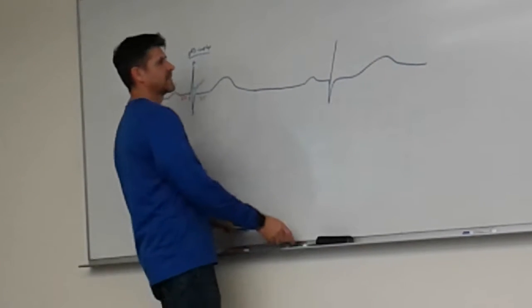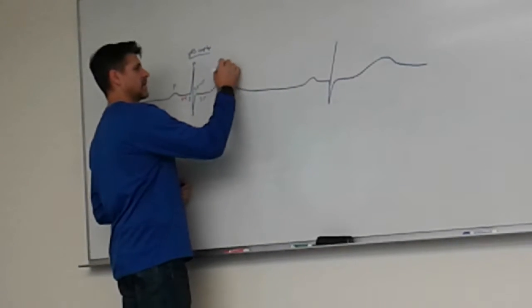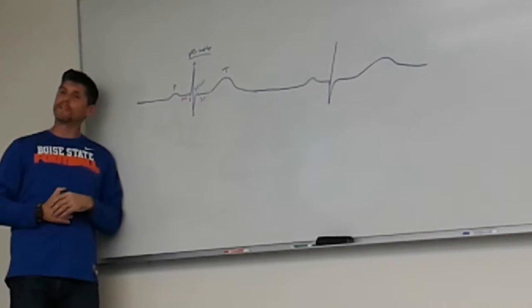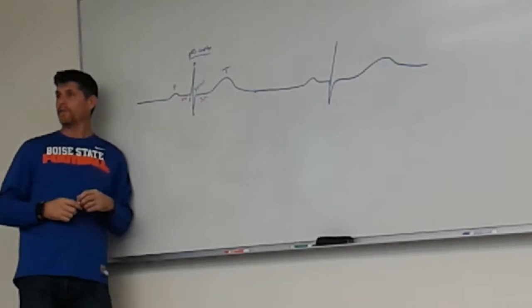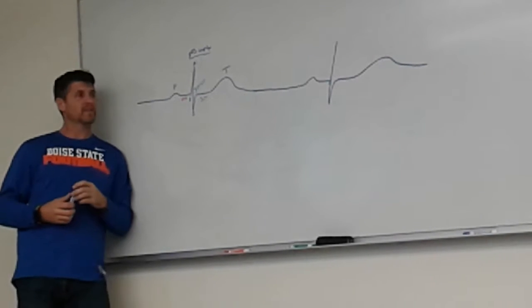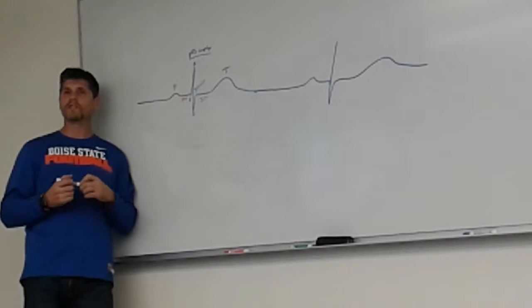After the ST segment, then what do we have? T wave. And then we have our T wave. Good? At the conclusion of the T wave, what do we have? U. Sometimes. TP segment. Good. So we can have a variety of things. It's possible we have a U wave. In some cases, there is a U wave. Under normal physiologic considerations, we typically don't see a U wave. We'll come back to when we do.